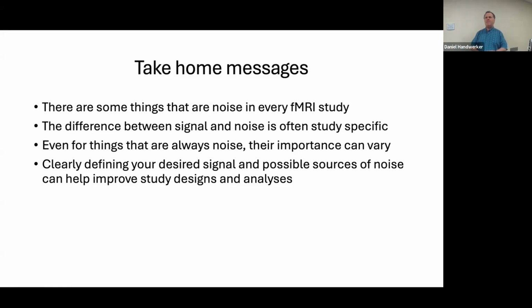The most common example people talk about for high frequency is your heartbeat, which causes a systematic variation in the signal. Your heart is beating somewhere between 40 and 100 beats per minute while you're lying on your back in the scanner. Typically around 60 beats per minute, that means it's a 1 hertz artifact. Then you have respiration, which is relatively high frequency, a breath every 3 to 6 seconds.